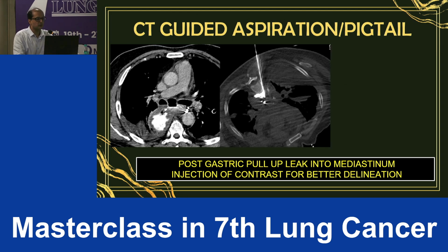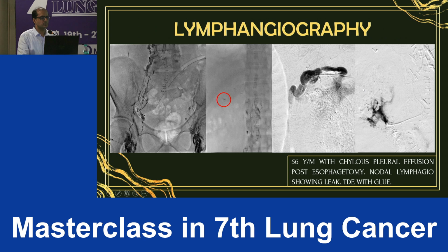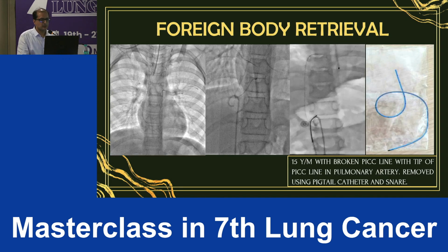Coming on to the non-vascular post-operative settings, whenever there is a collection, a drainage pigtail catheter can be placed for doing the drainage, be it in the mediastinum or in the lung. So this is a lymphangiography in a post-operative patient. What we see here is the Lipiodol. We inject it into the inguinal lymph nodes. After that, when we see the leak into the mediastinum, this is when glue embolization of the lymphatic ductal system is carried out in the thoracic duct and in the cisterna chyli.